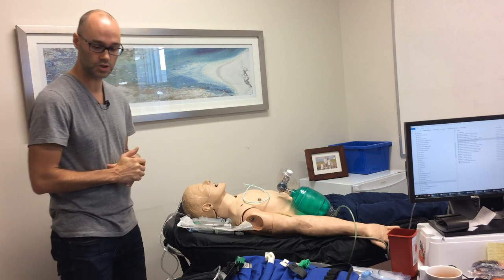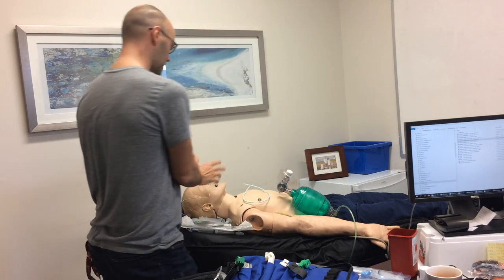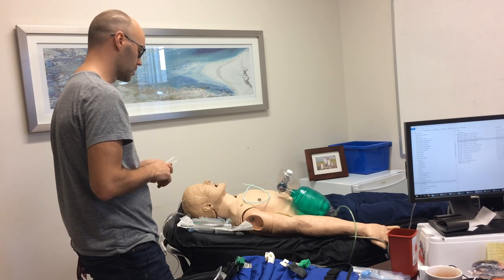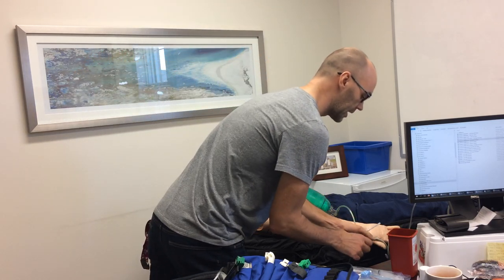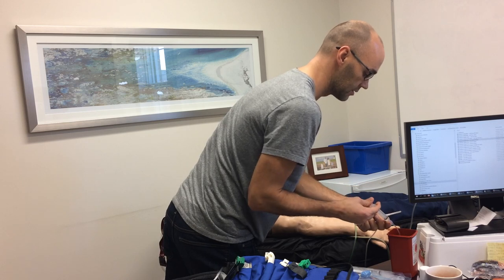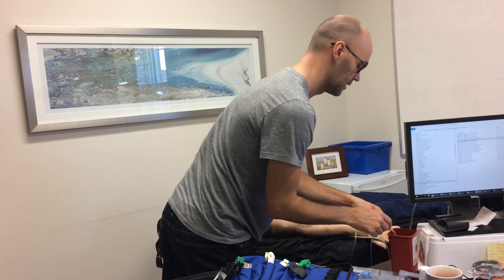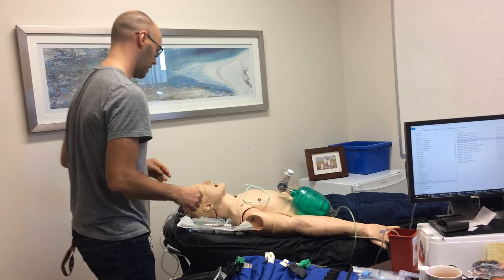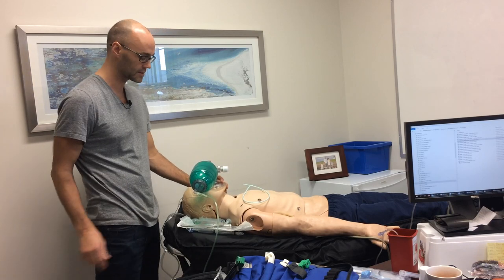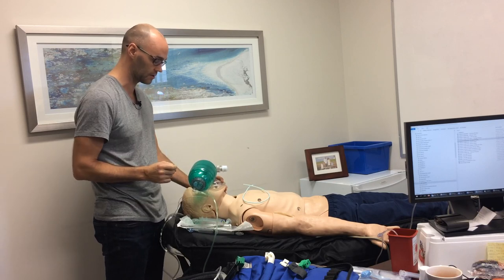We're now at the point that we can push our drugs. I'll pull my ketamine. I'm just going to confirm once again my sats and encourage my partner at the head bag valve masking not to take the bag valve mask off the patient's face until we're sure the patient's apneic, and just wait until I get to the head. I'm going to push my ketamine first — in goes ketamine into my patient's IV. In goes our succinylcholine. I'm going to come to the head and take over my bag valve mask from my partner, and remind them: when I take the bag valve mask off, can you please switch over to the high-flow nasal so that we can take advantage of some apneic oxygenation.